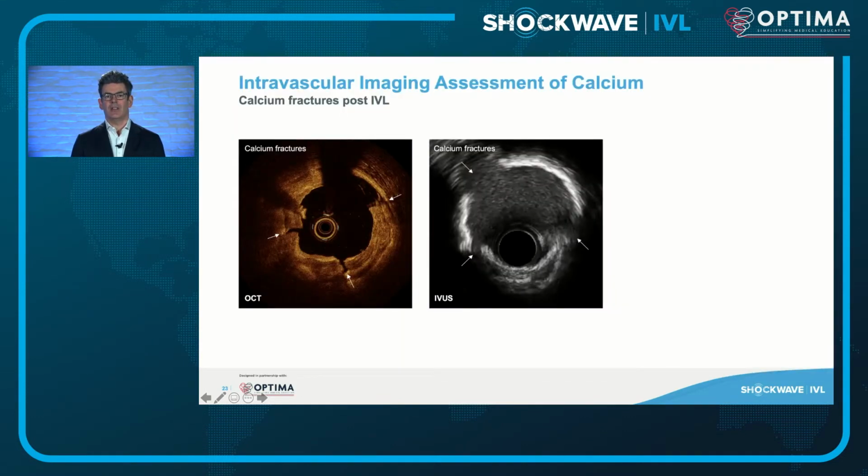Intravascular imaging of calcium pre and post shockwave is extremely useful to demonstrate the mechanism of action. And it is clear that you can see this with both OCT and with IVUS. So in both these panels here, you see calcium fractures.